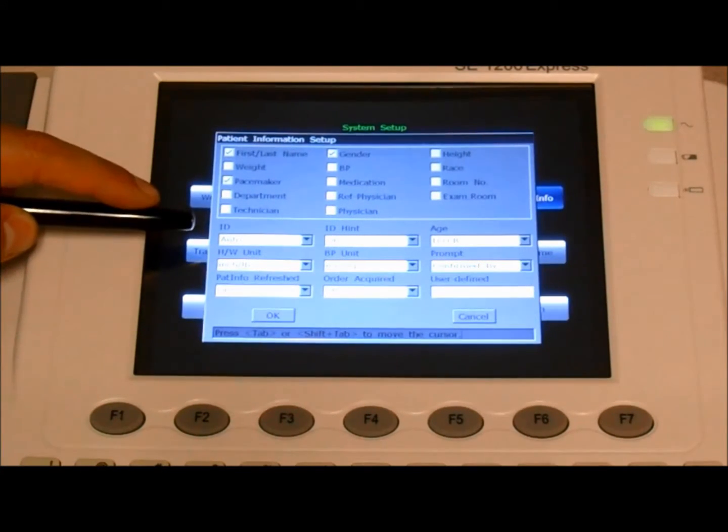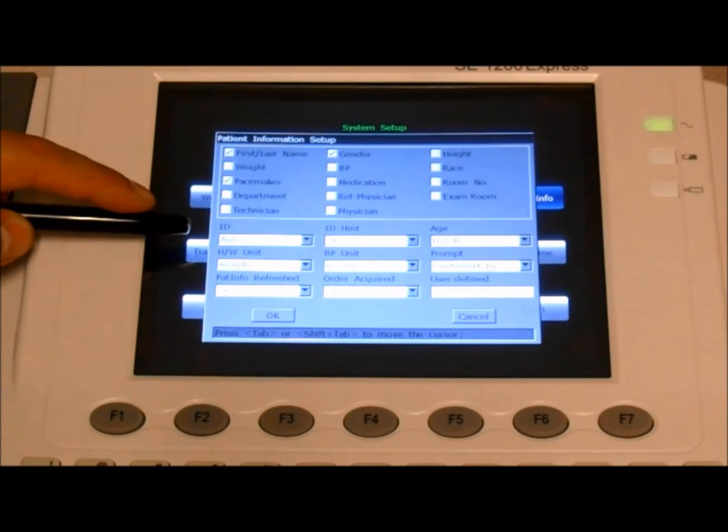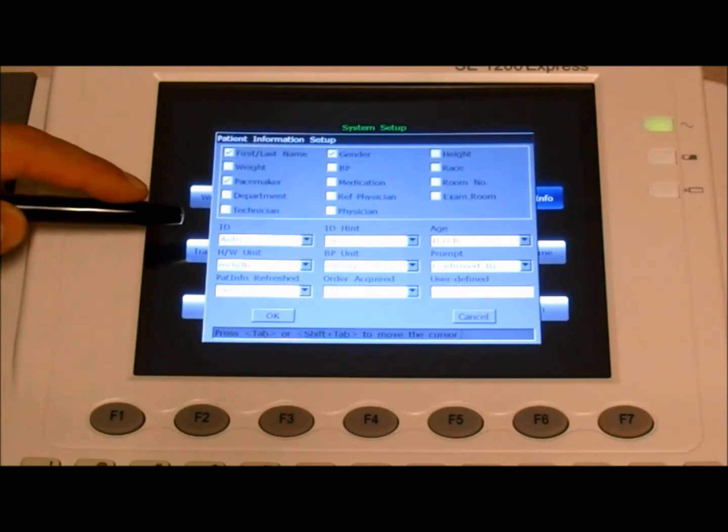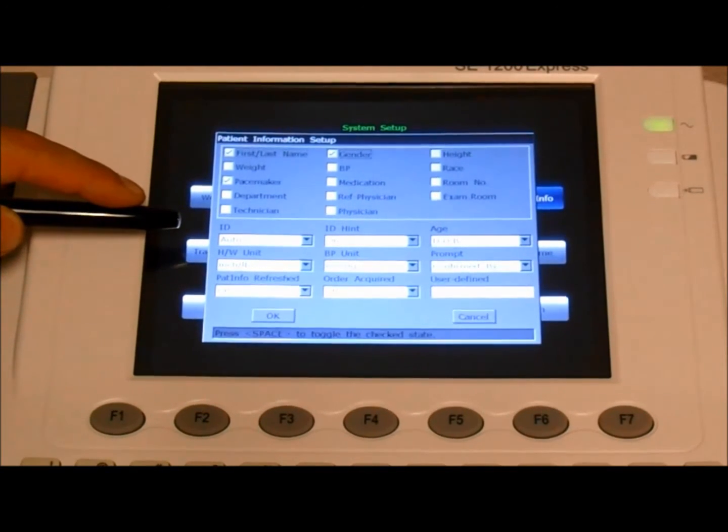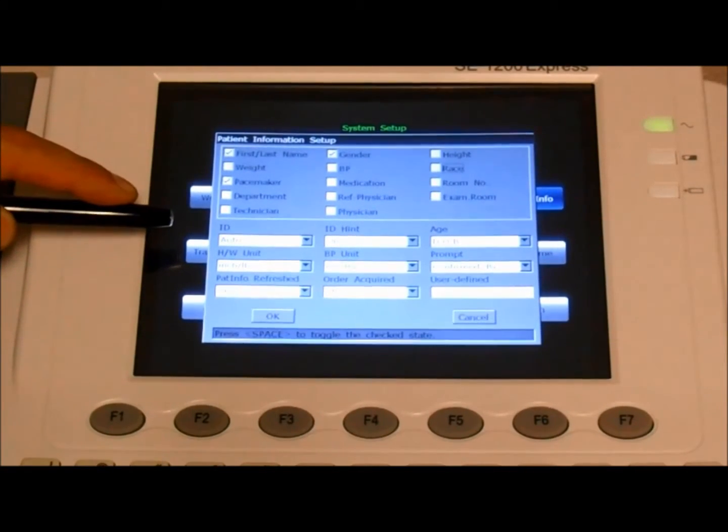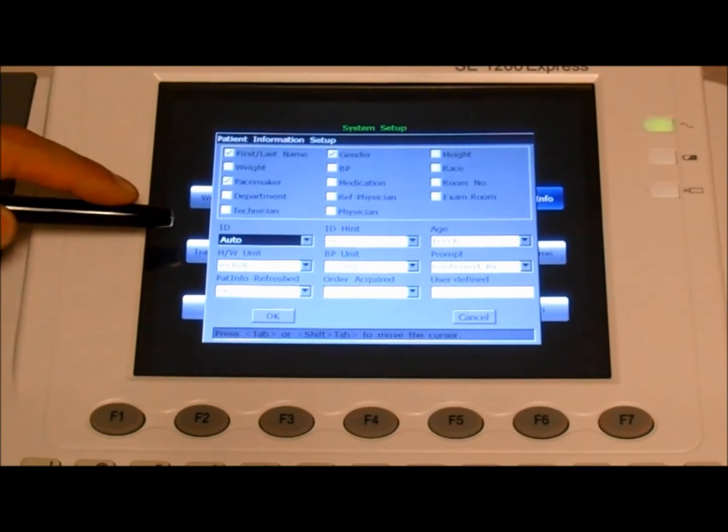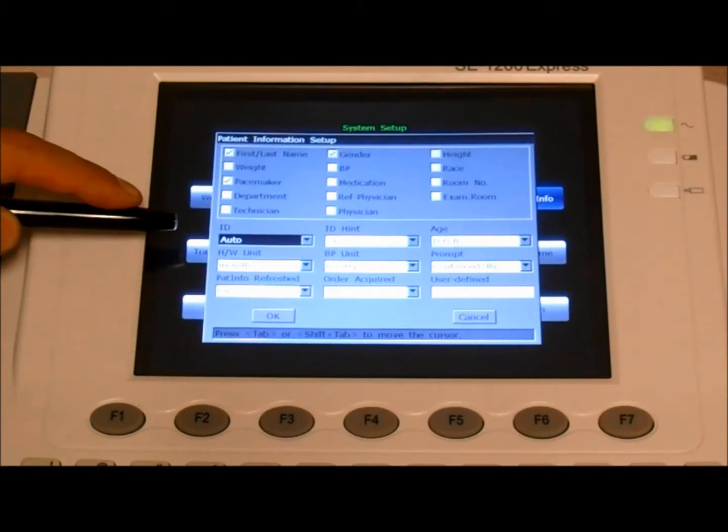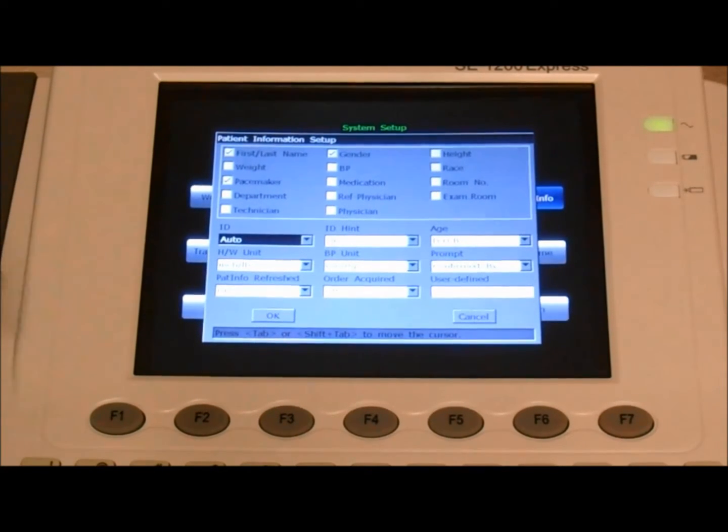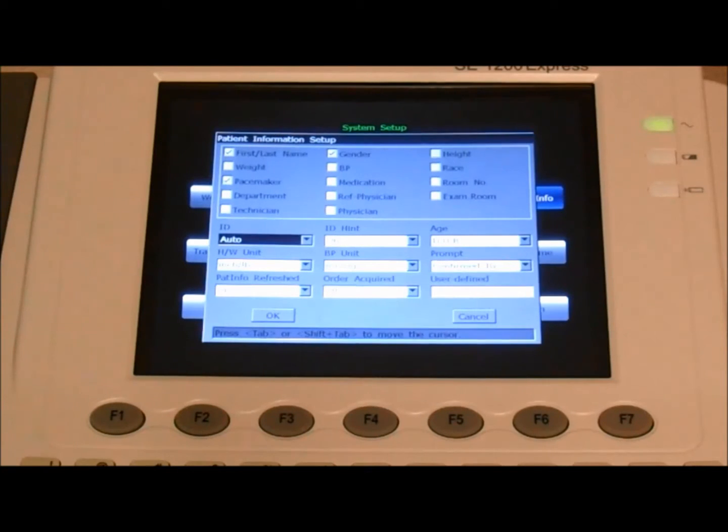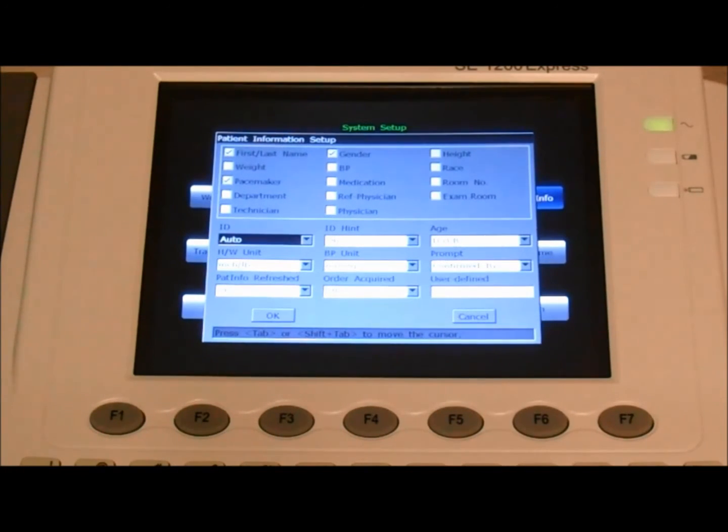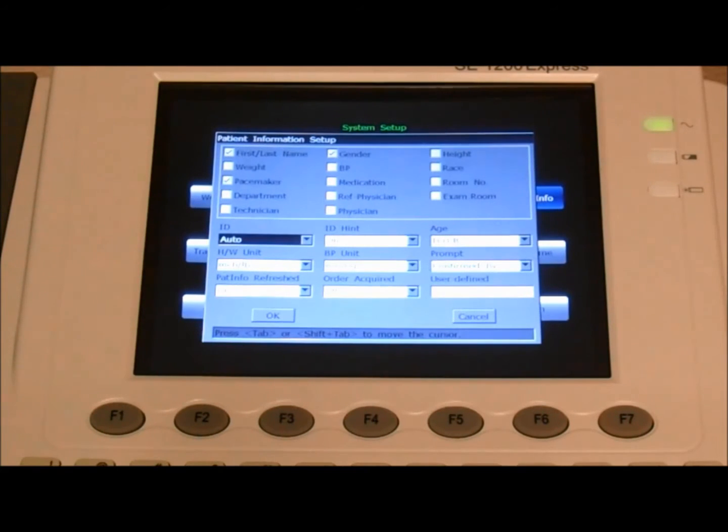For ID, the generation of the ID, there's three different options. We have auto, where the unit automatically advances from the current number to the next number. If you have a new patient, it'll go, for example, from zero to one.